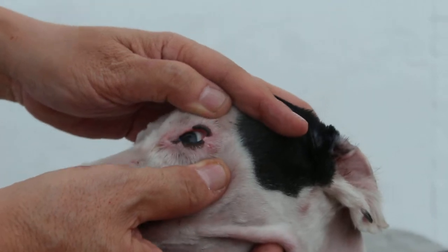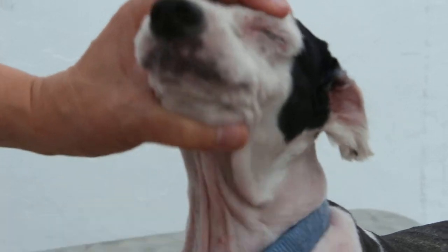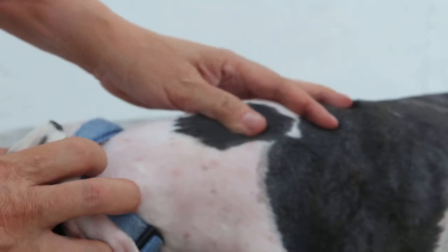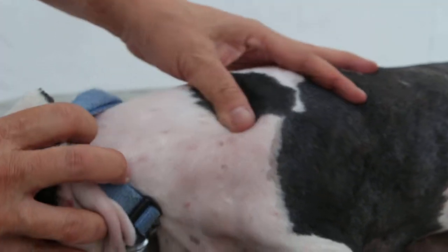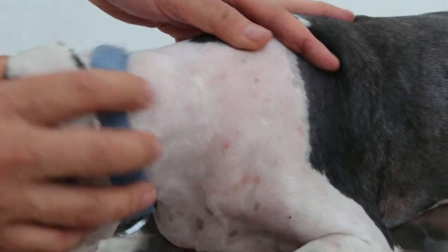Step 2: Blood Test. This dog's blood test shows leukocytosis, which means a high white blood cell count of 33, when the normal is 6 to 17. It also shows neutrophilia — a high neutrophil percentage of 89%, when the normal is 60 to 70%.